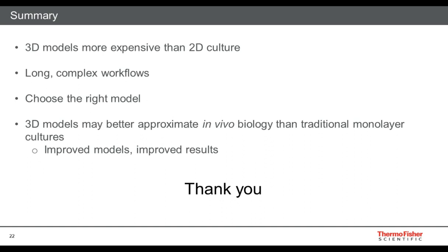Really, it's just a way of trying to identify as early as possible in your protocol whether or not things are progressing in the manner that you want them to progress in, so that, one, you either continue to culture, or if you look at your gene expression and you find you have what you feel is an unacceptable level of off-target differentiation into cell types that are not important for your model, then you've probably reached a decision point where you can stop and start over and try again.